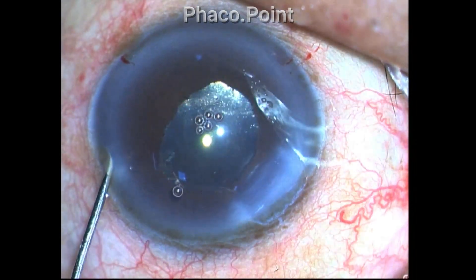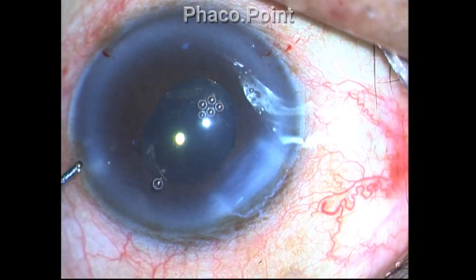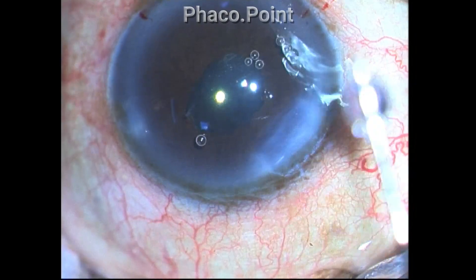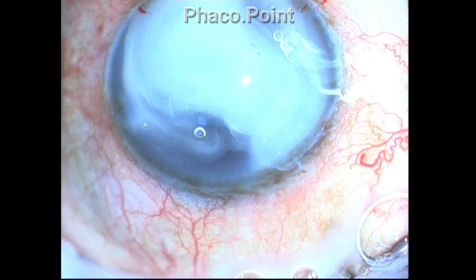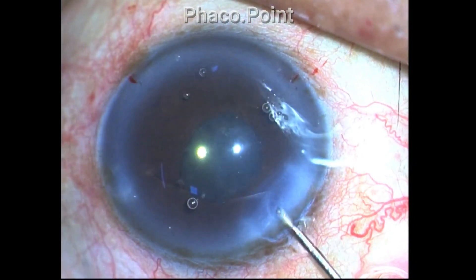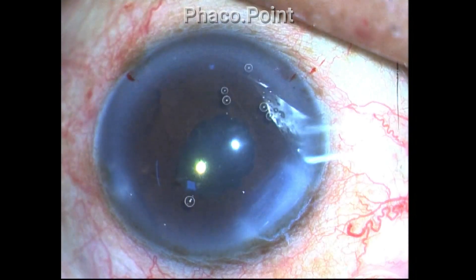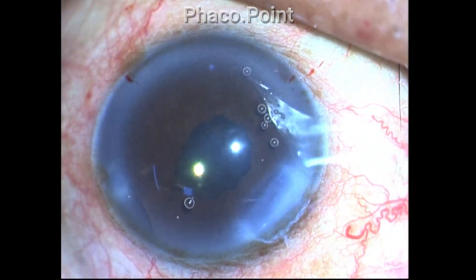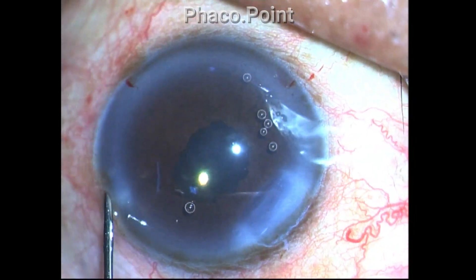A little amount of pilocarpine is then injected to create a narrowing of the pupil; however, it did not induce much miosis — likely because of microsphincter tears induced by the use of the pupil dilating device. Finally, triamcinolone acetonide is injected into the anterior chamber and washed out, which reveals the anterior chamber to be completely free of vitreous strands extending to either the side port incision or the main incision. The presence of a little triamcinolone acetonide in the anterior chamber will also have the additive anti-inflammatory effect.